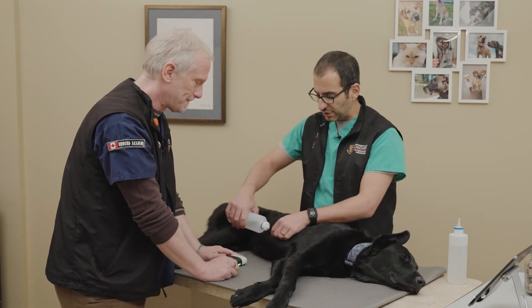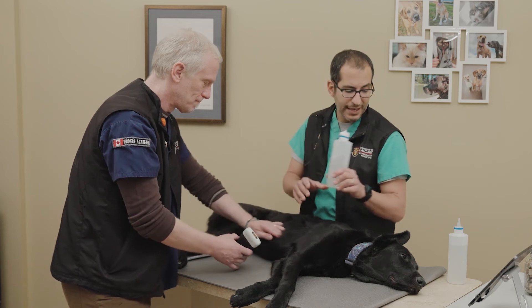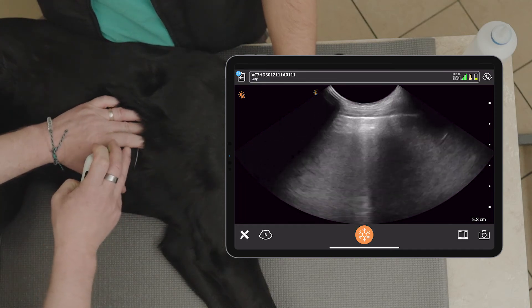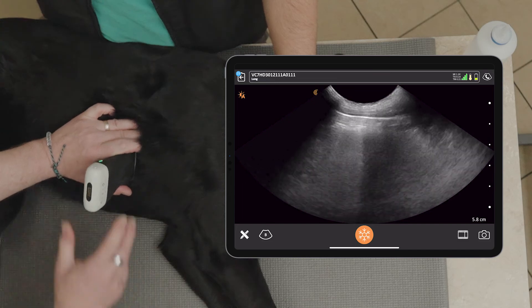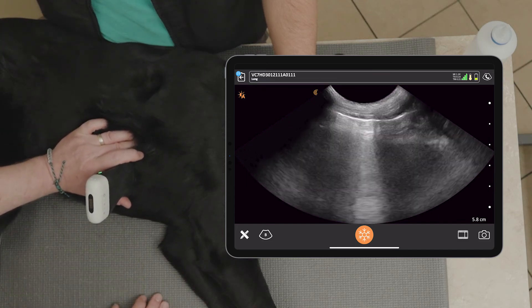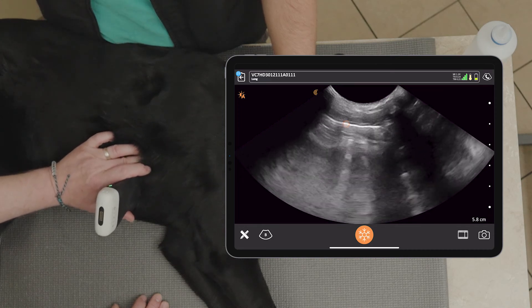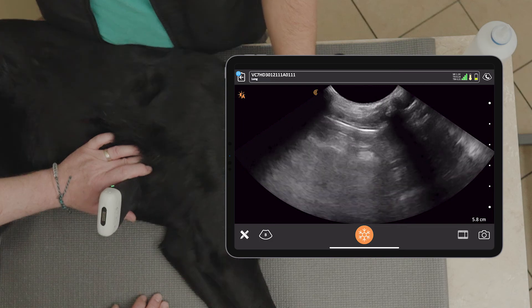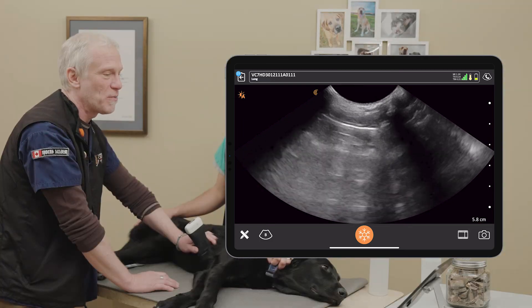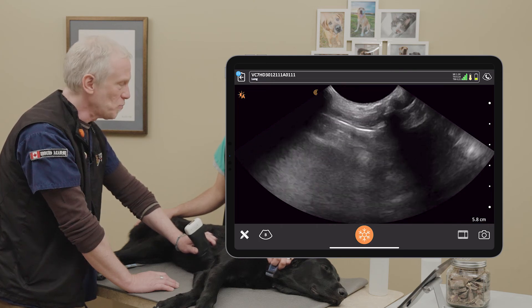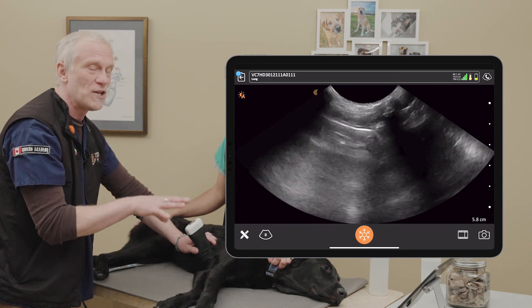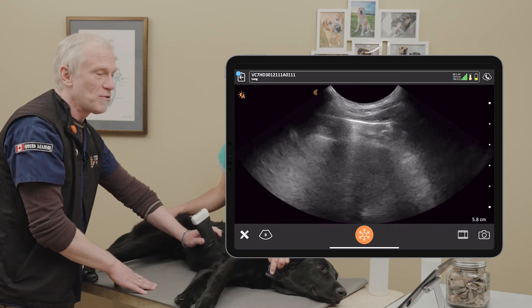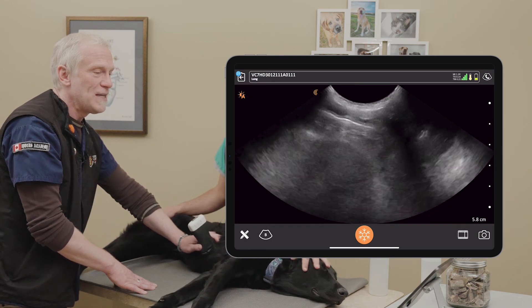Ventrally, we have two borders. I like to turn the probe parallel to the ribs with the marker pointed dorsally, and slide straight down between the ribs until I hit the cardiac notch or see the lung start to curl at that sternal border. That is the sternal ventral border — the pleural border where we see the ski jump sign, where the lung is curving away from the chest wall along the sternal muscles. It's really easy with ultrasound to find those key borders and know where pathology accumulates based on patient positioning.